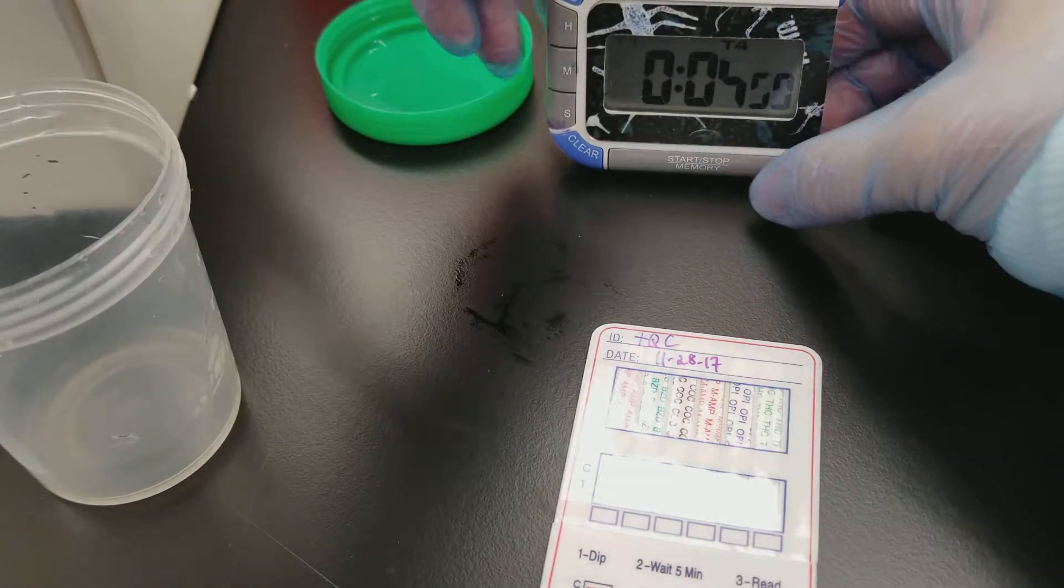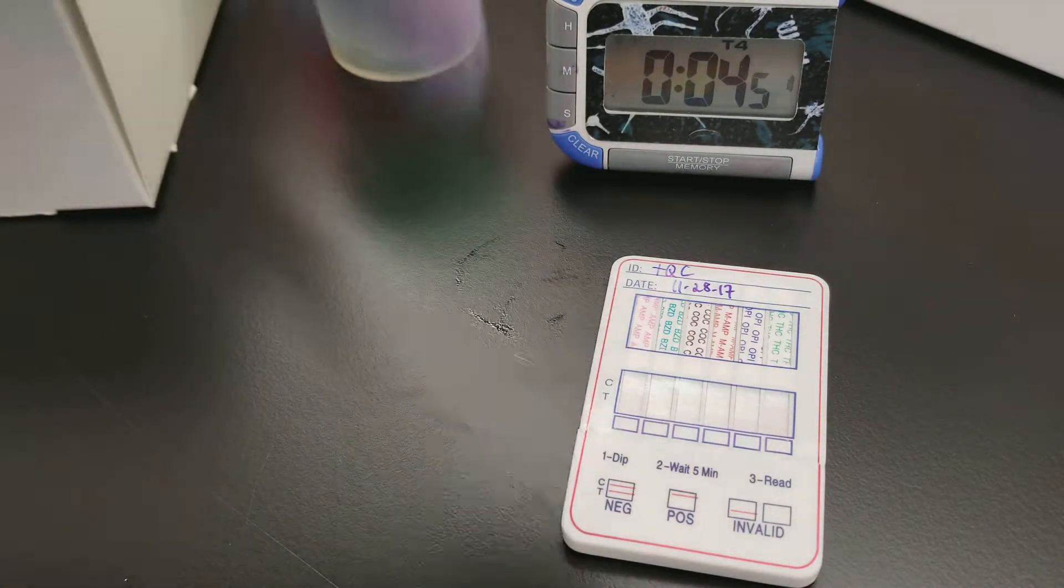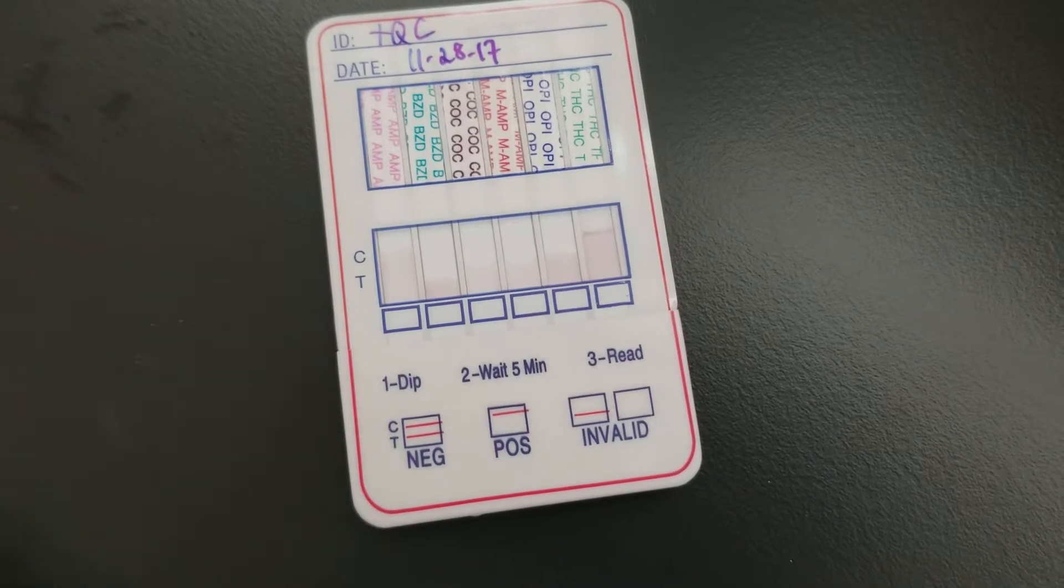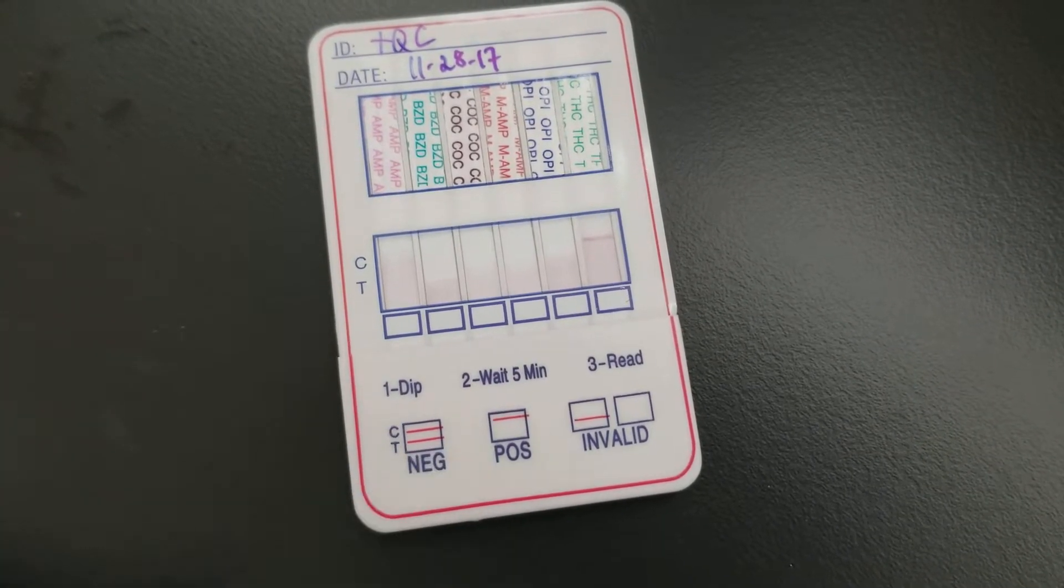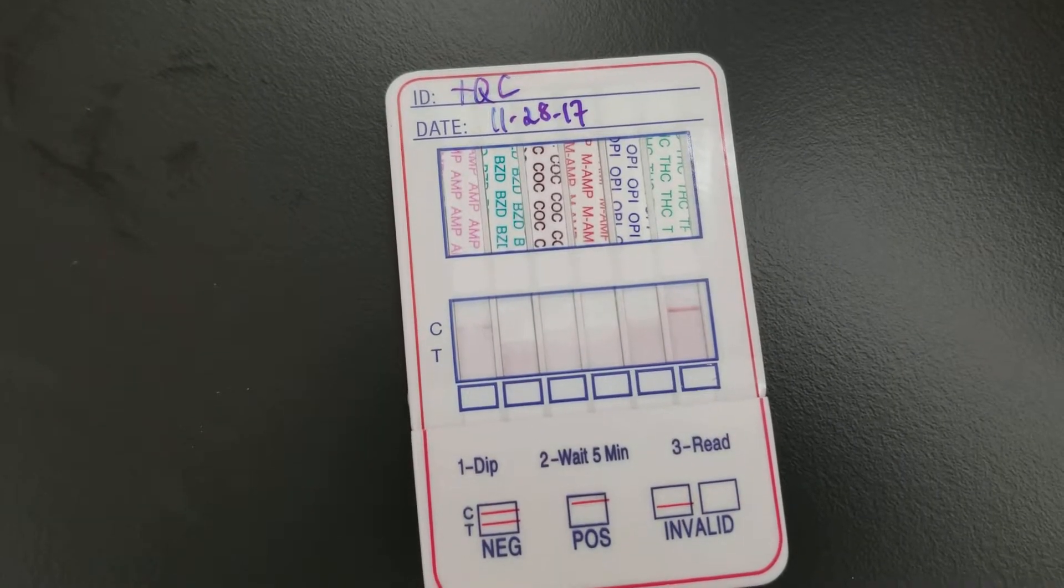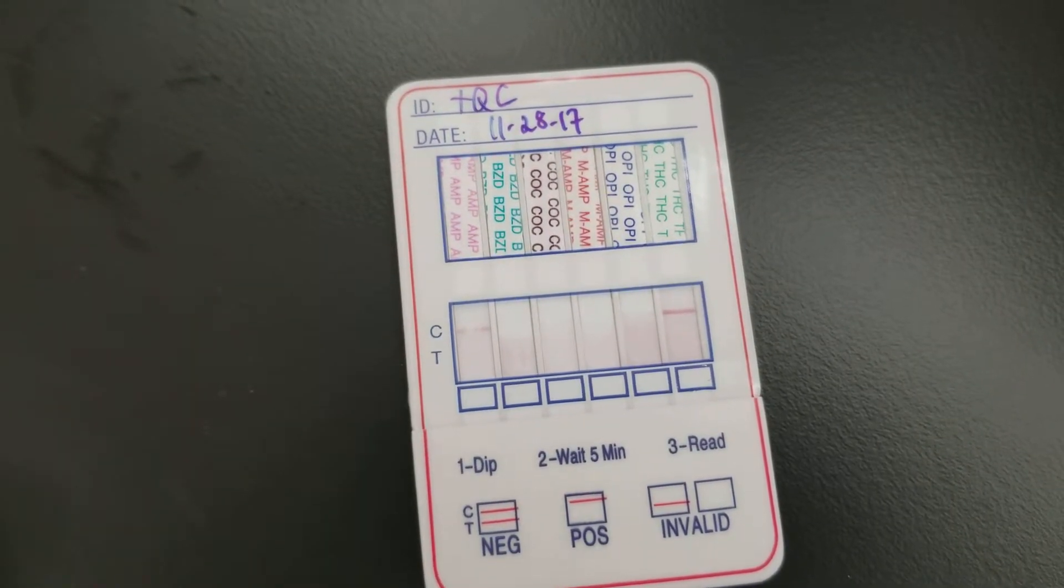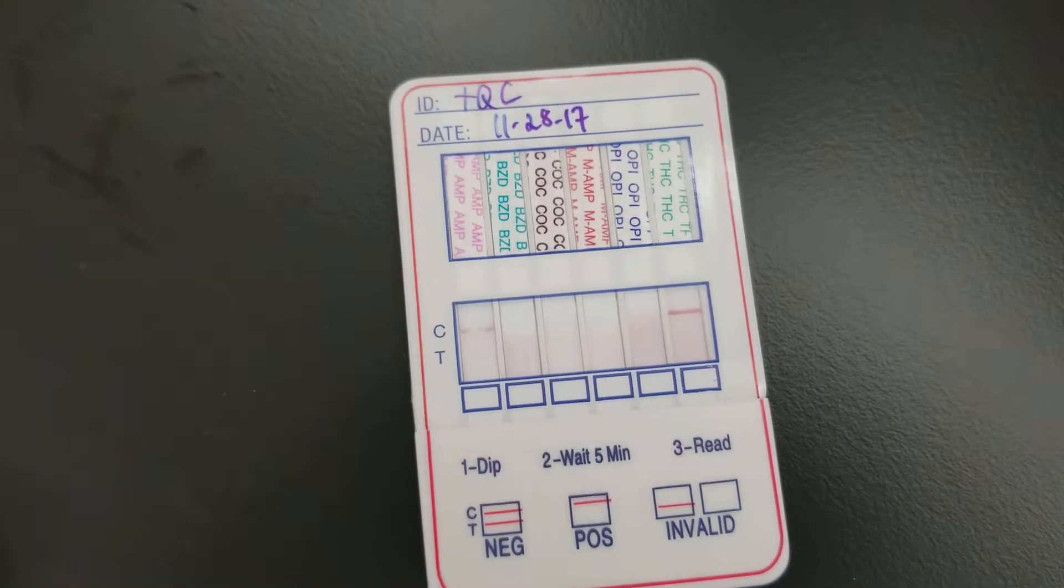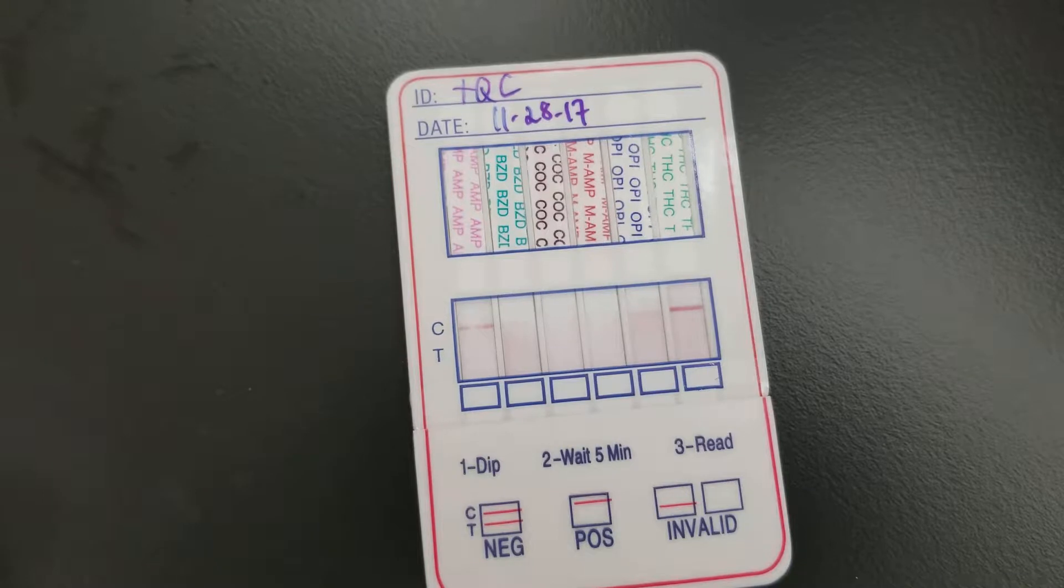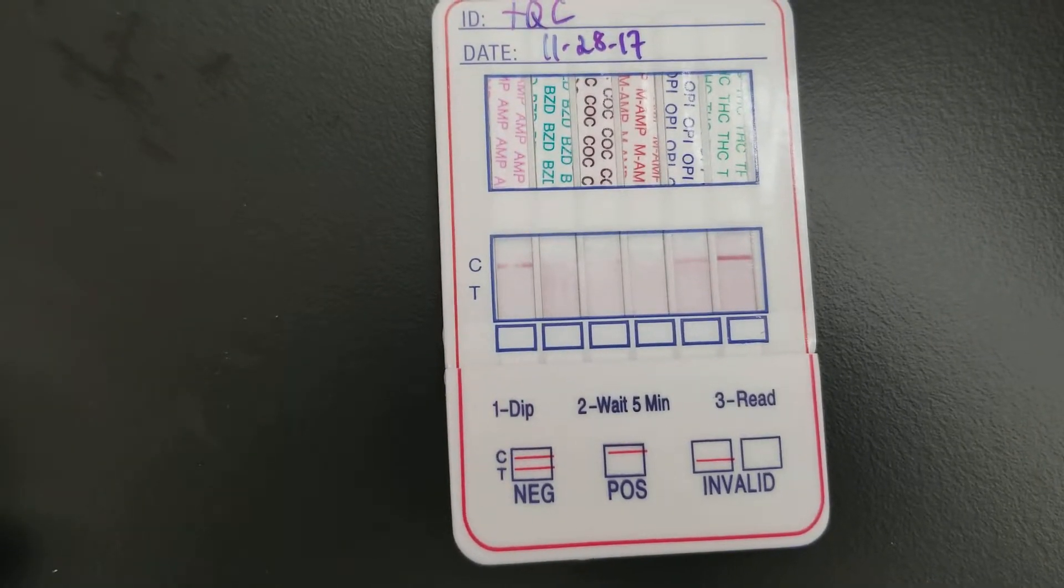The weird thing about this card is that if you look at the interpretation on the cover, it says that when you have a control line and a test line that are there, it's negative, whereas the control line alone is positive, which is totally weird because that usually is not what you would expect to see.